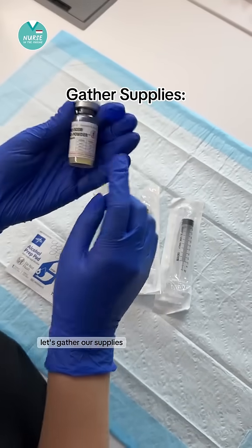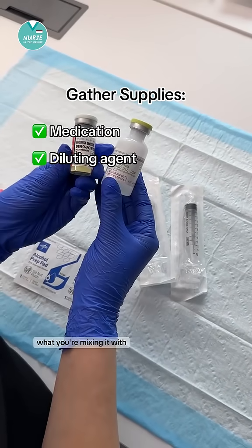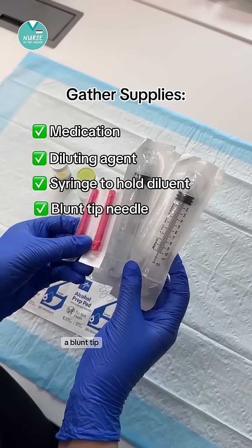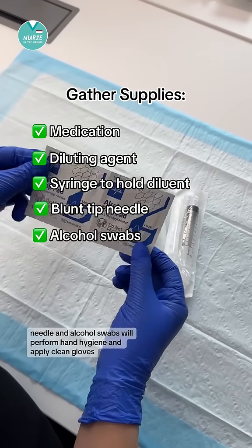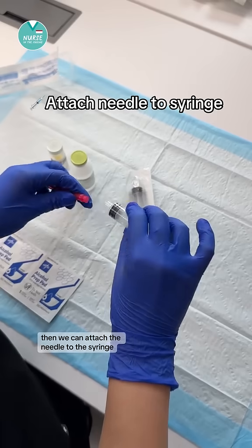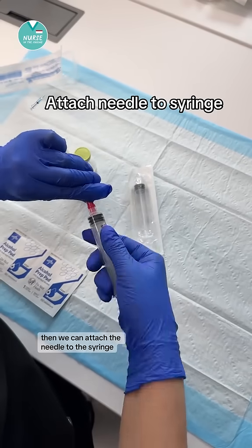Let's gather our supplies. You'll need your medication, what you're mixing it with, a syringe large enough to hold the mixing agent, a blunt tip needle, and alcohol swabs. We'll perform hand hygiene and apply clean gloves. Then we can attach the needle to the syringe.